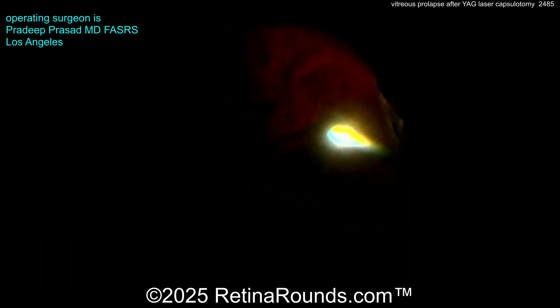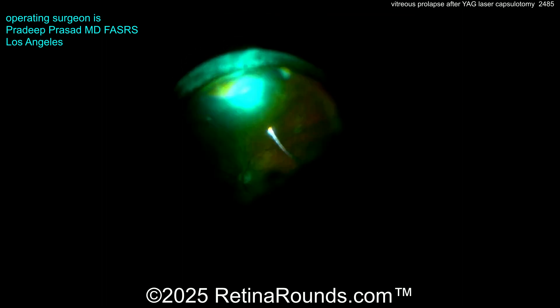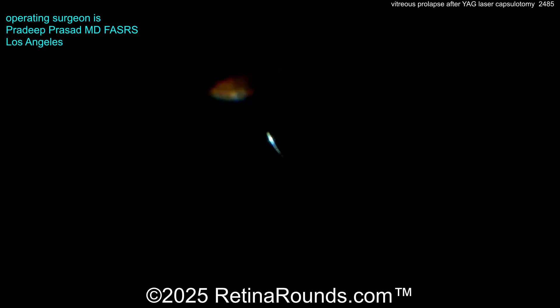In this particular patient's eye, we actually did identify a very small tear with no subretinal fluid. So we went ahead and treated that with laser photocoagulation — you can see that being administered here.